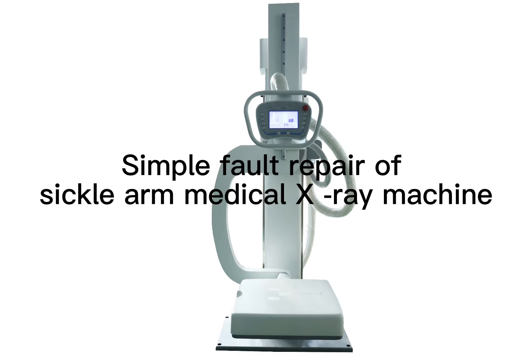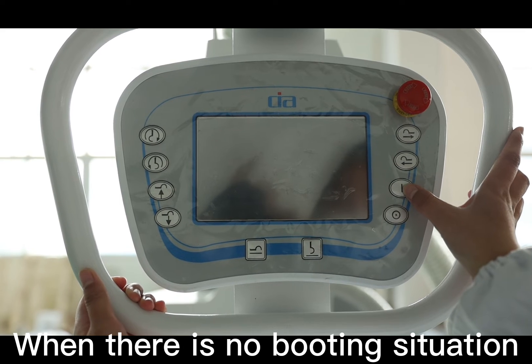Simple fault repair of Seeker R medical x-ray machine when there is no booting situation.